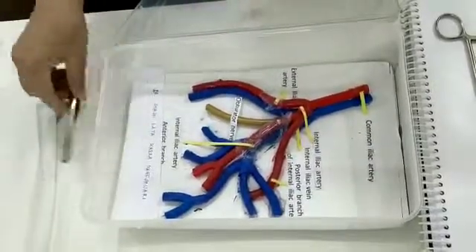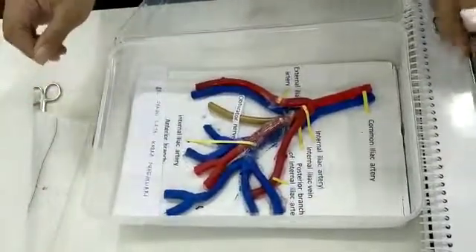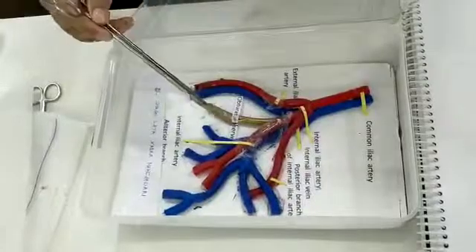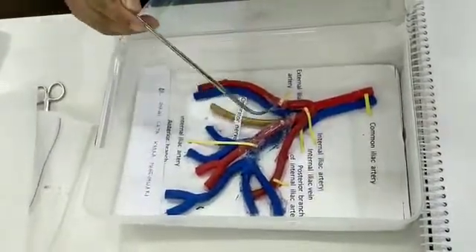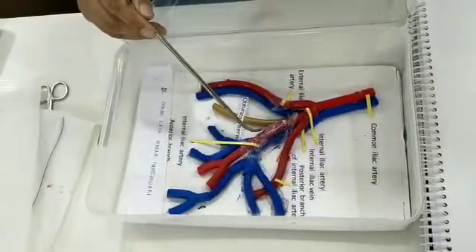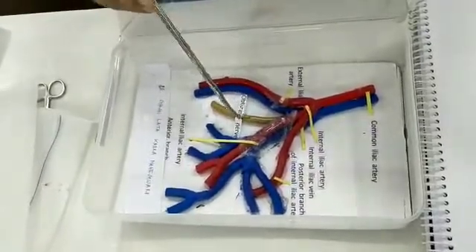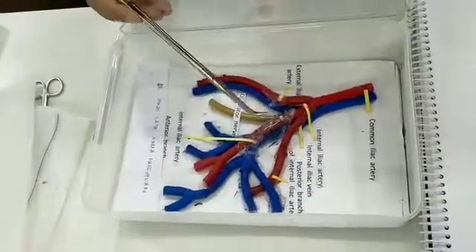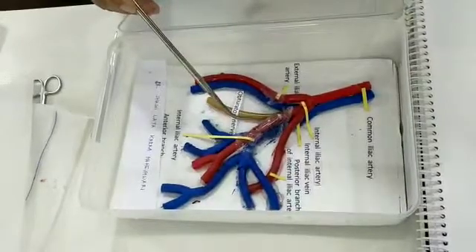It is usually covered with a sheath, and that sheath we have to dissect. I take a right-angle forceps for dissection of the sheath, and it should have a movement in the longitudinal direction and parallel to the artery. If we make a perpendicular movement, it will injure other vital structures like external iliac vein and internal iliac vein.